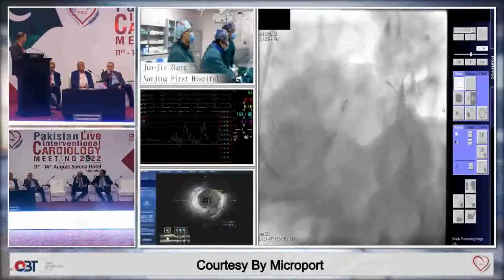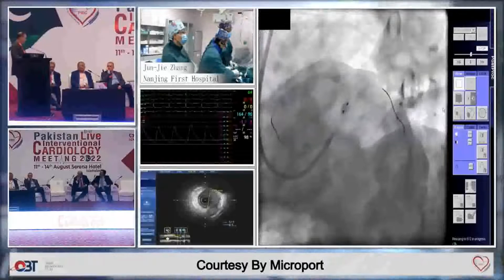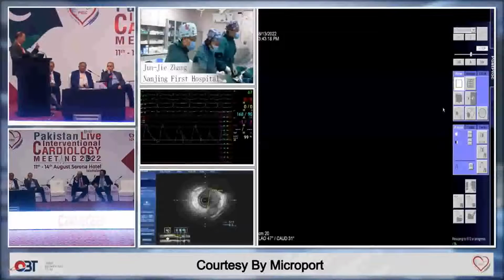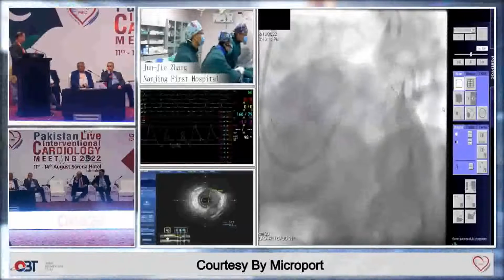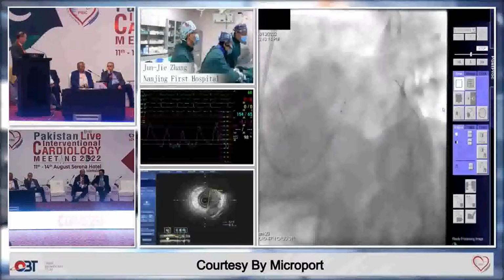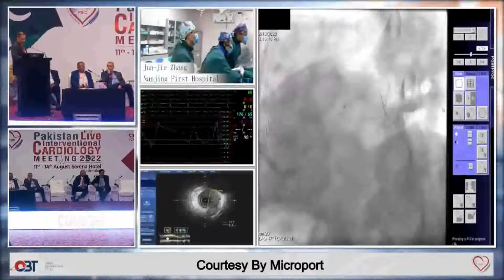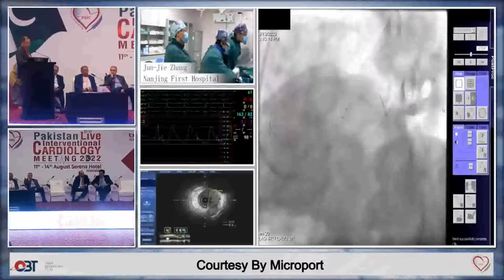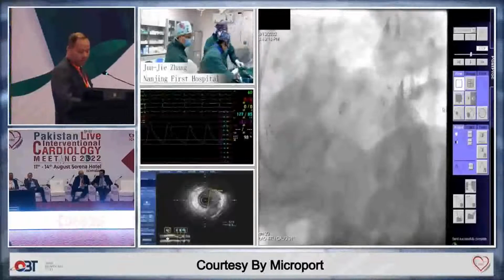It's a Chinese-made device. All of these are very short, and it's very difficult to get it.